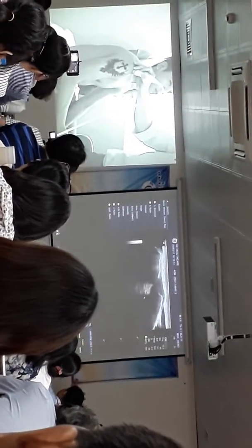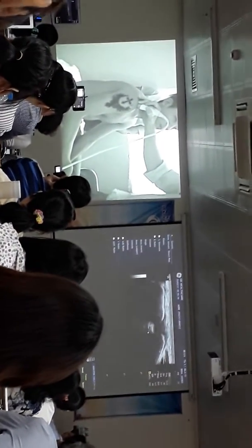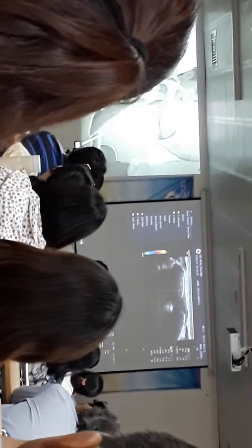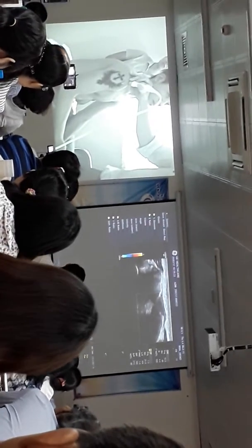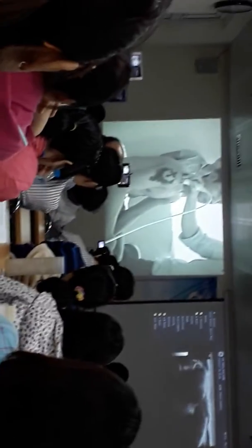If we see osteophytes or erosion of the bony surface, we would diagnose AC joint arthritis. In the setting of active synovitis, you can put colour on to see if there's any hyperemia of the synovium. If there is synovitis, there will be increased vascularity around the AC joint. And you can assess the structural integrity of the joint by assessing it functionally. So we assess both the anatomical structure and the function of the AC joint.